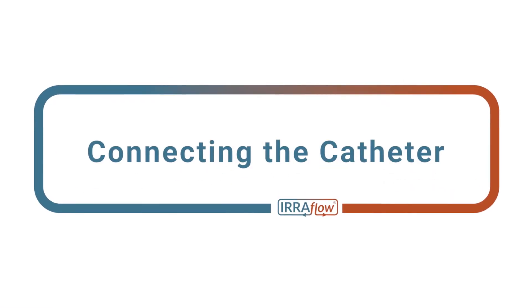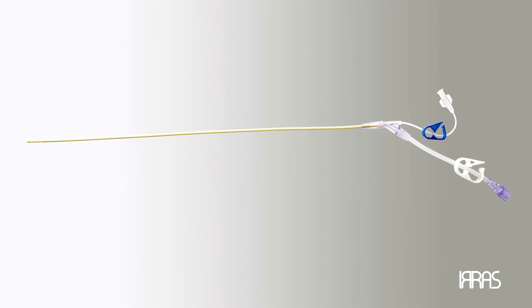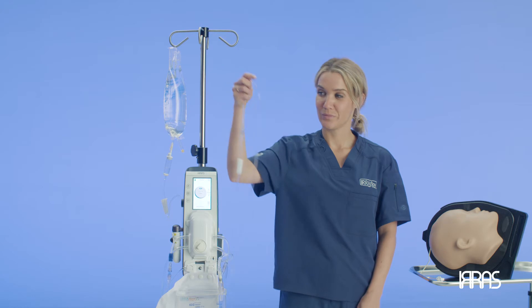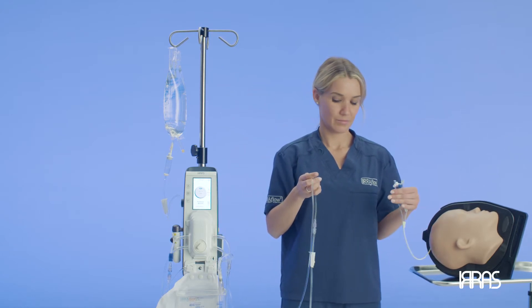Chapter 5: Connecting the catheter. Once the Aeroflow catheter has been safely placed into the desired treatment area, it is now time to connect the Aeroflow dual lumen catheter to the control unit.